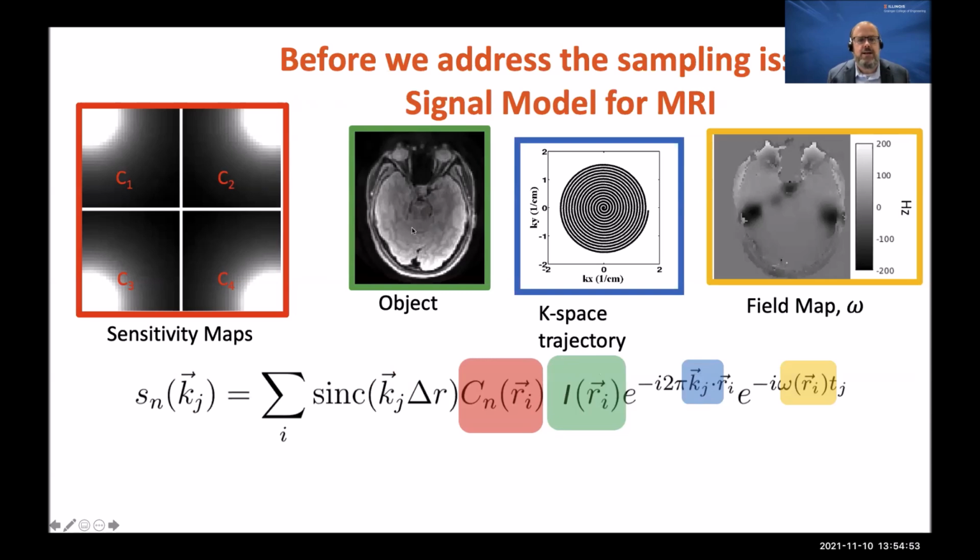I tried to color code these things so you can see what we're talking about. This may be the image we're trying to get. And there's a couple of other effects that may happen too. Just listening to Kazu's talk, there are a lot of things that can happen to blur the image. We have magnetic field inhomogeneity. We expect the magnetic field to be uniform, but there are things in there, including air spaces in the brain, that disrupt the magnetic field uniformity, and those will cause blurring.